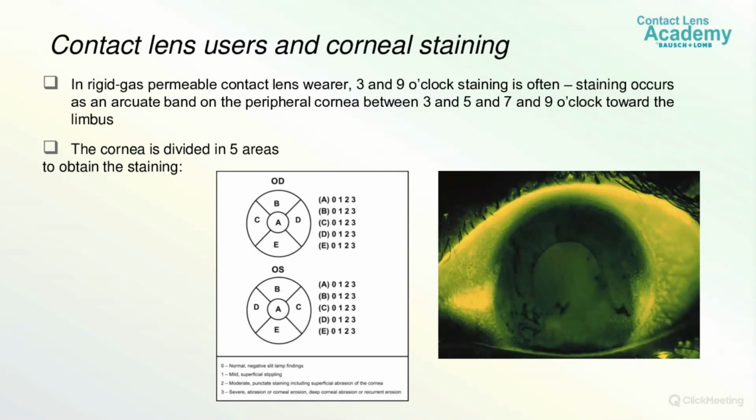Again, I will show you the Oxford system chart with the conjunctival and corneal staining in dry eye disease cases, or for those patients who wear contacts and suffer from dryness, because all these conditions may be present when you are screening for dry eye disease. With this example, you may learn how to apply both the Efron grading scale and the Oxford system chart.